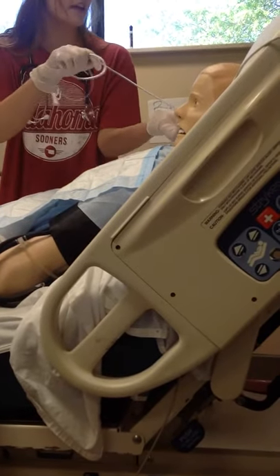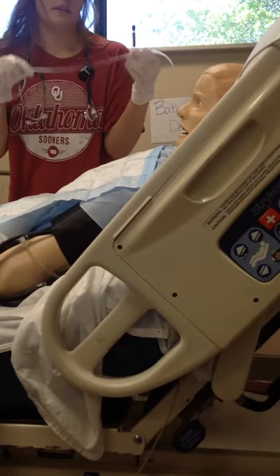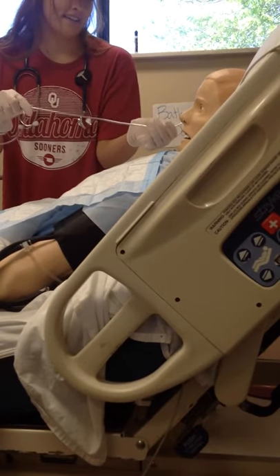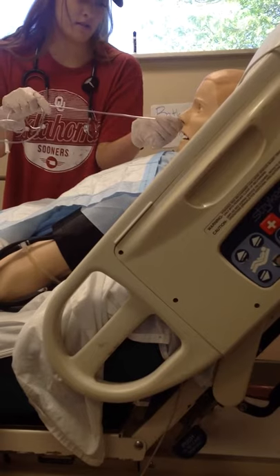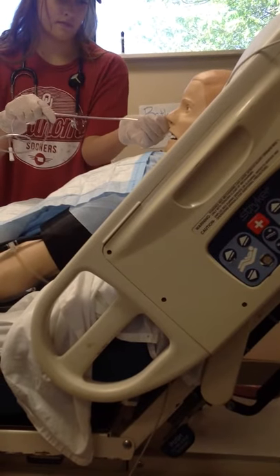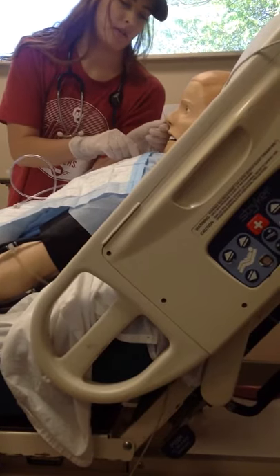Oh, I need to measure it first — from your ear to your nose and down to your xiphoid process, and mark that with a piece of tape. All right, here we go for real. Now tilt your head down. Here's some water if you need it. I'm going to mark that so we know if it moves any.